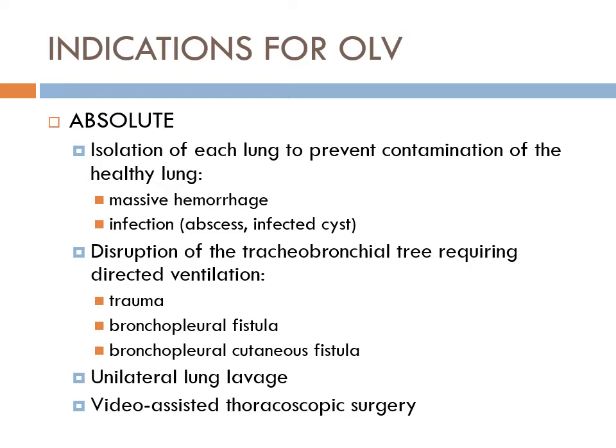I'm trying to think of a way to take a blood pressure cuff, I guess a manometer or whatever, and somehow outfit that to do the cuff pressures, because those are only $20. But as soon as you turn to a handheld one that can release the air in one hand, where you squeeze it, it's got a little dial on top, and you can release the air, it's like $150.